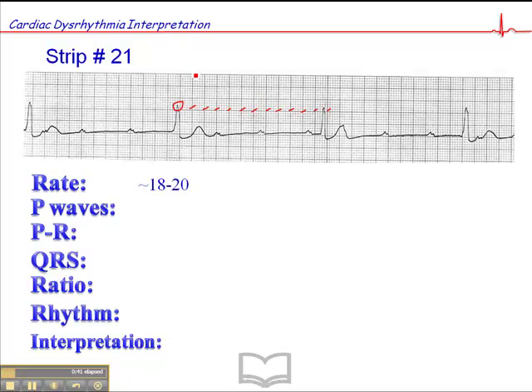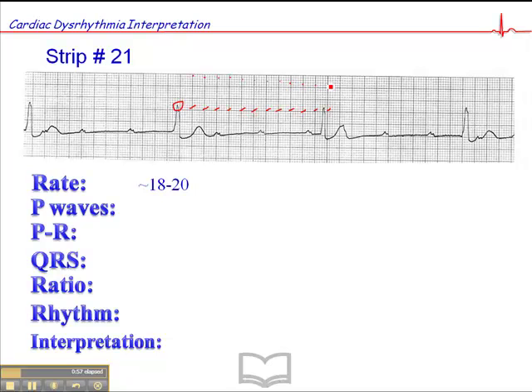The other thing you can do — and I know we didn't get past 33 — is count the number of dark lines between the QRSs and divide that into 300. So counting: 1, 2, 3, 4, 5, 6, 7, 8, 9, 10, 11, 12. So 300 divided by 12 gives you approximately 25.